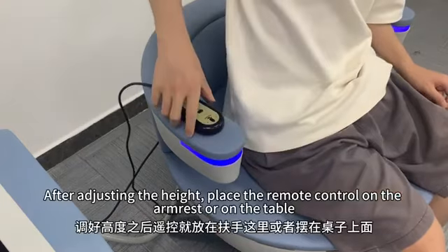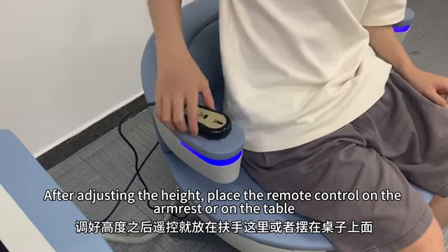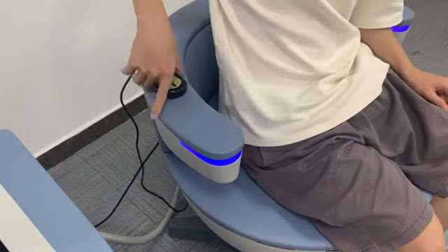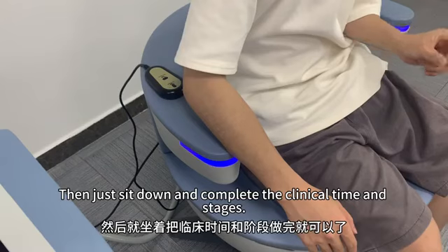After adjusting the height, place the remote control on the armrest or on the table. Then just sit down and complete the clinical time and stages.